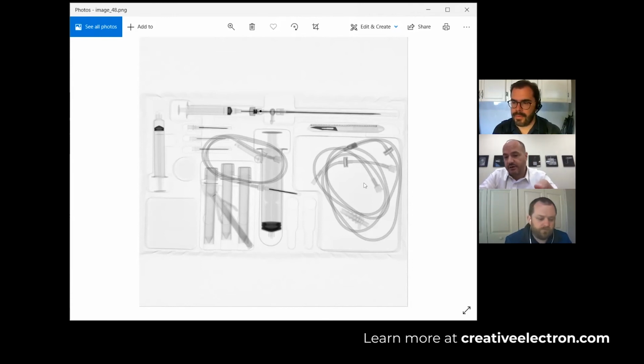And that's where we deploy artificial intelligence. With artificial intelligence, we can train what a needle looks like, and we can train AI to find a needle at different positions of the tray. Over time, with more samples, as we look at more images, AI does a pretty good job finding the needle in the haystack, if you will. So it's the difference between the well-conceived problem that machine vision can answer and the ill-conceived problem, which is what AI looks for.